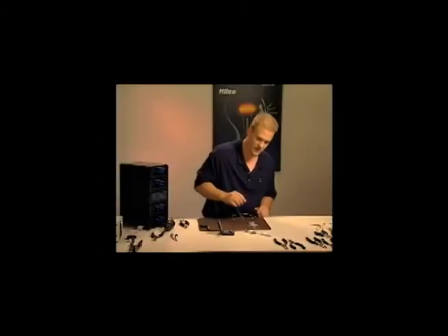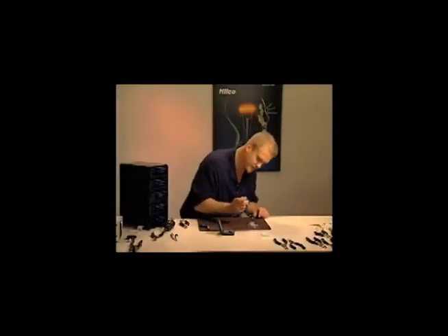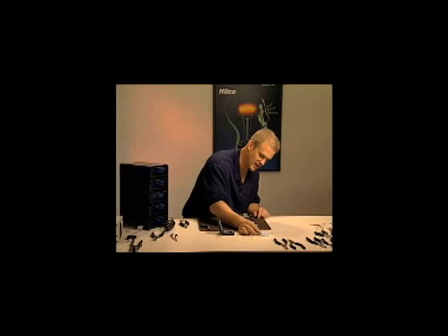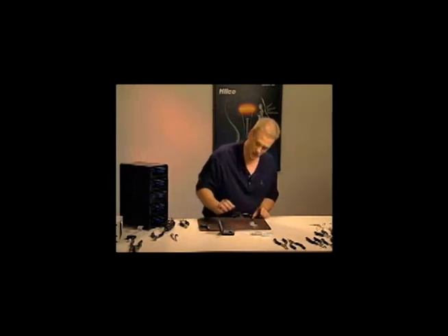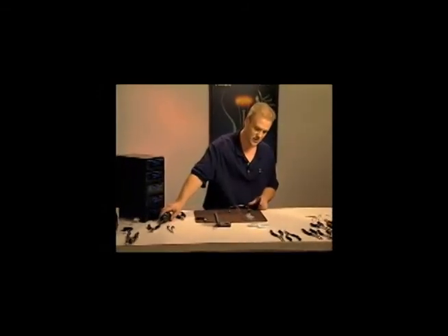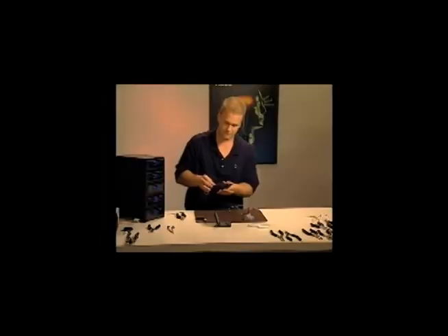Now we're gripping the screw top and bottom, and we're ready to add a little bit of oil. I use this pinpoint oil that has some cutting oil in there, which is the best oil to use for drilling. Using oil is absolutely necessary. If you don't use it, you really risk the drill bit binding in the guide, or even in the screw if you're drilling freehand. And if you break that drill bit off in the frame, you're really looking at some soldering work. There's no way you can drill out a drill.